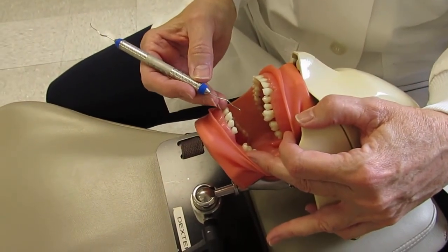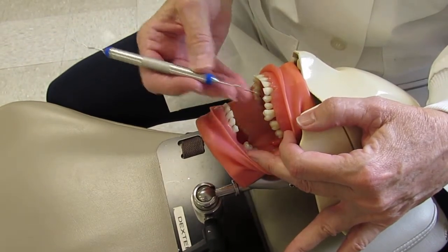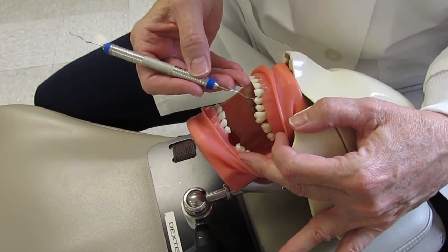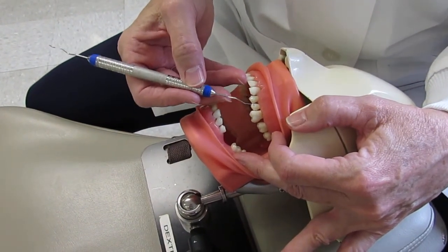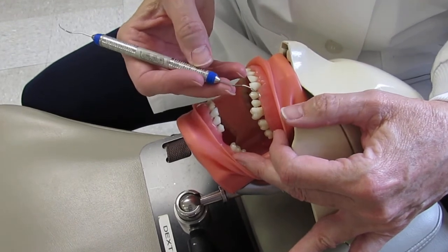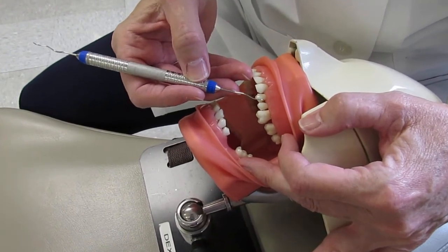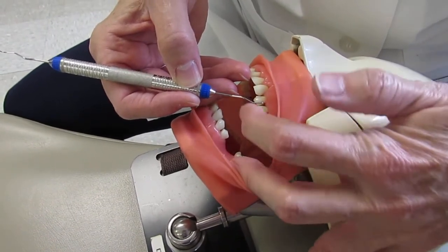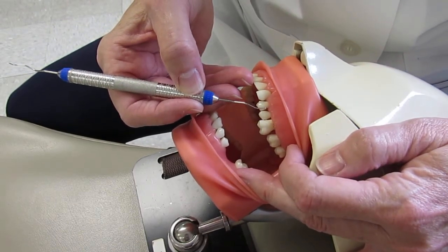How do we determine which is the correct working end to use on any sextant? You can go to any sextant and pick a tooth, go to the distal surface. Place the pointed tip on that distal surface — for example, number 12. If the terminal shank is parallel to that tooth and the functional shank is over that tooth, that would be the correct working end.